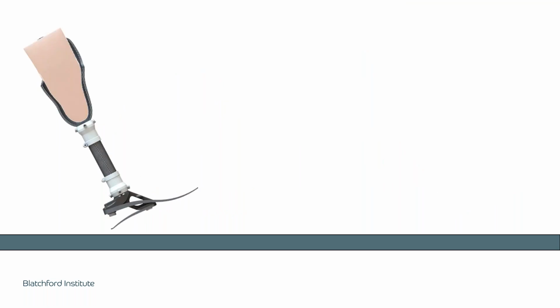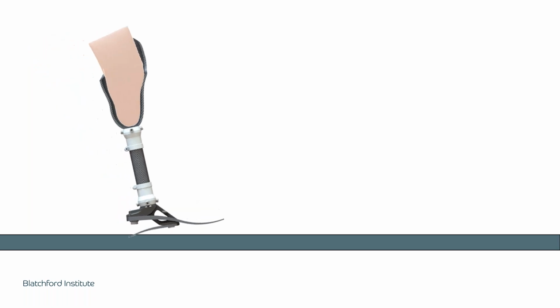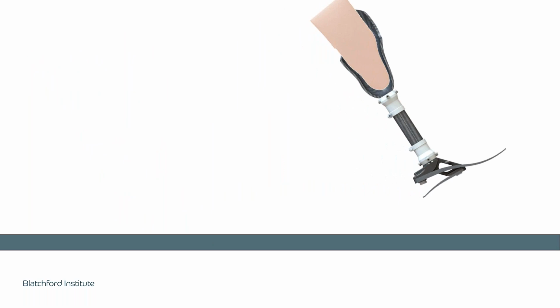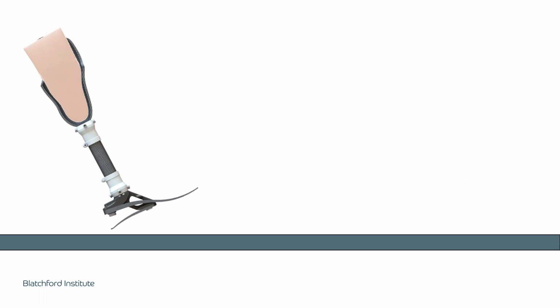Next, this is how a lower limb amputee might walk with a not particularly very good socket, but that's intentional, to deliberately exaggerate and highlight the points we're trying to make. So this time I'm going to repeat what I just showed, but this time, as we did with the healthy limb, we're going to show distances.